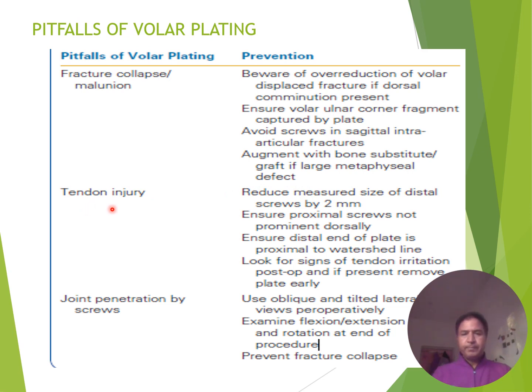Tendon injury. Reduce the measured size of distal screws by 2 mm. Ensure proximal screws are not prominent dorsally. Ensure the distal end of the plate is proximal to the watershed line. Look for signs of tendon irritation postoperatively. Joint penetration by screws.